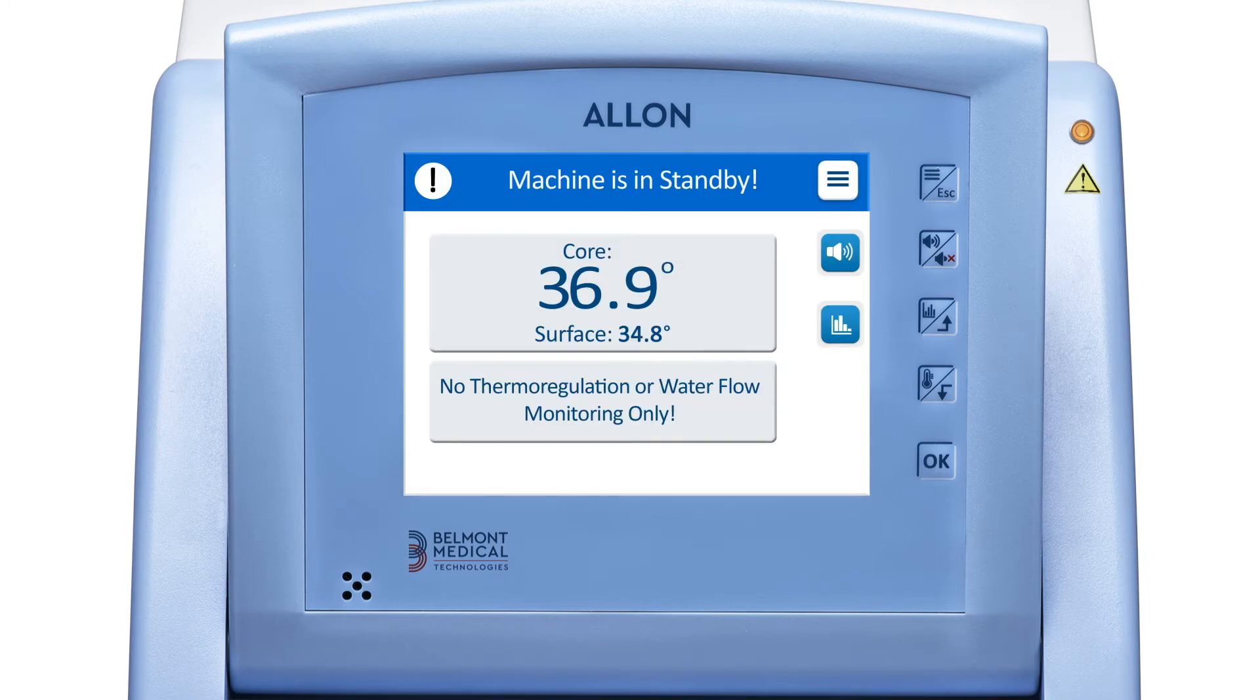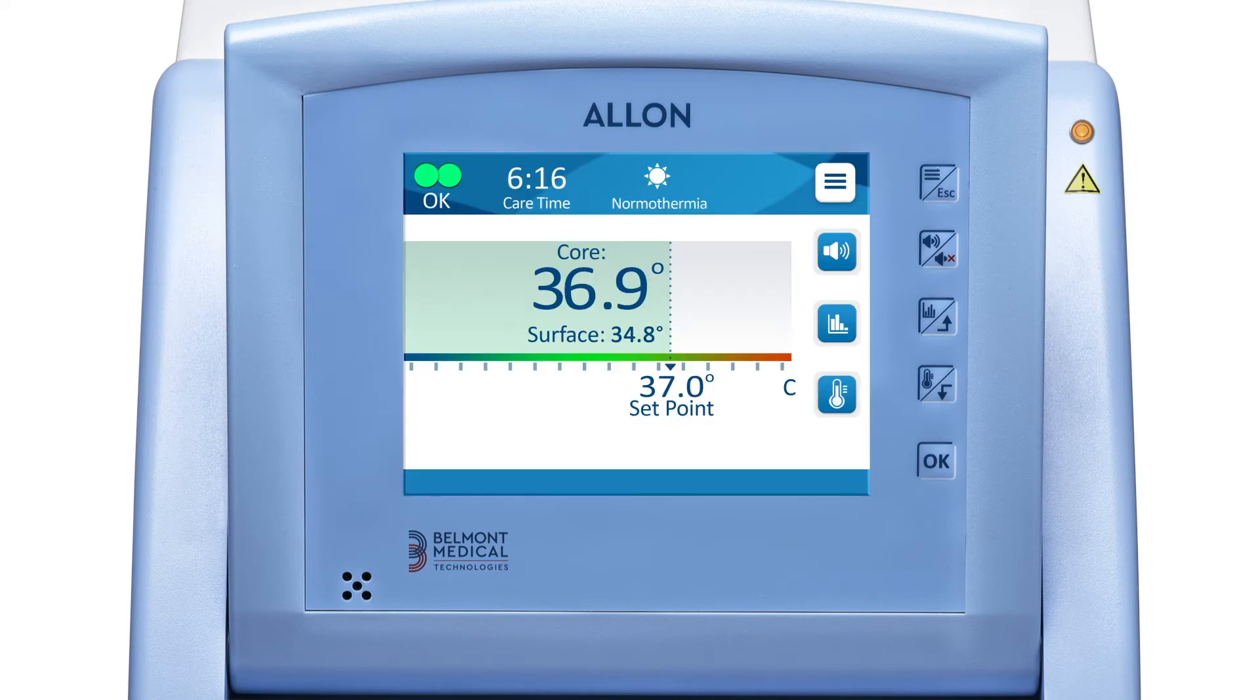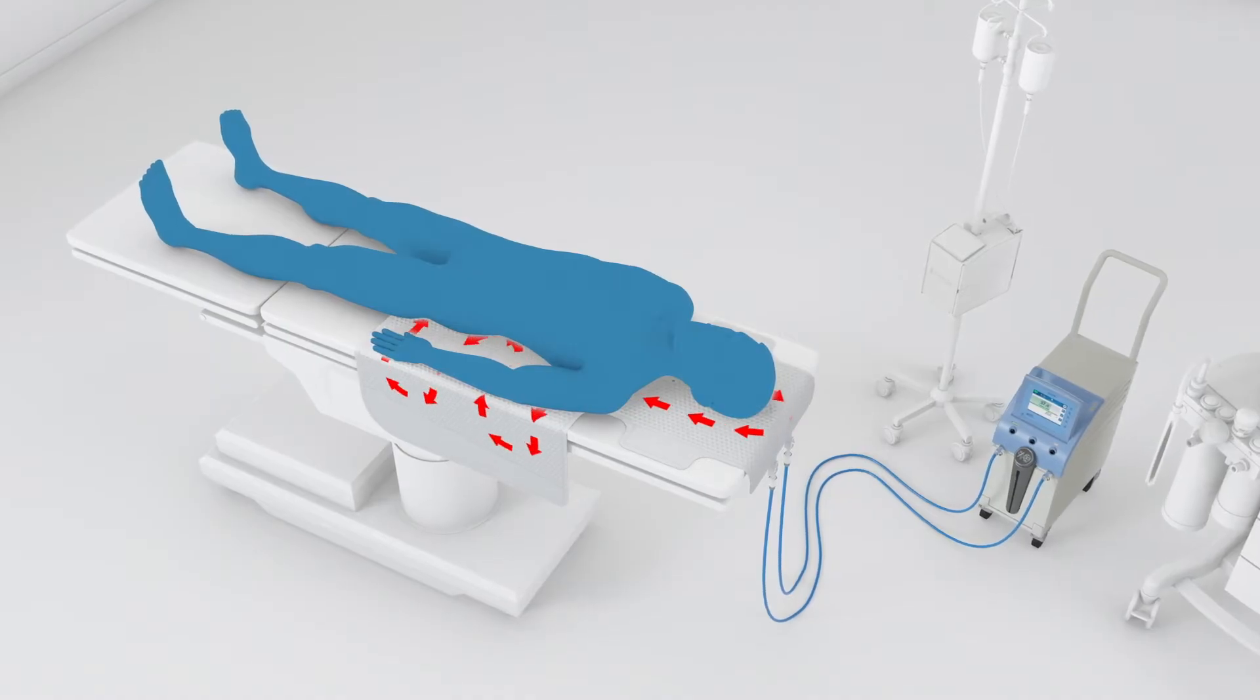To exit standby mode and continue regulating temperature, choose menu, then operate. Water will begin filling the wrap.